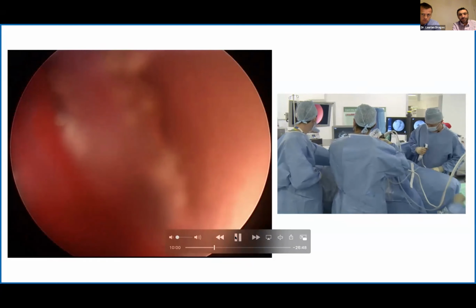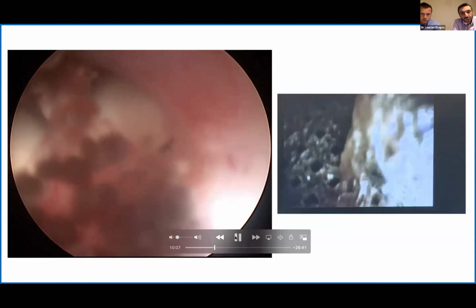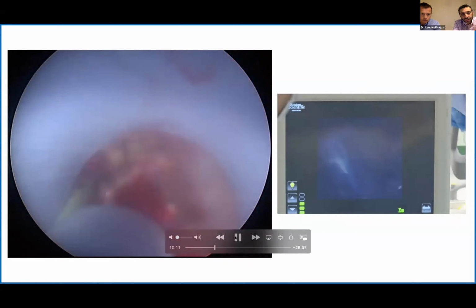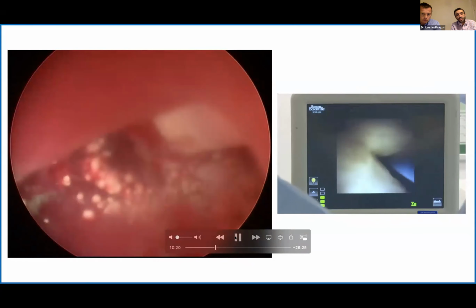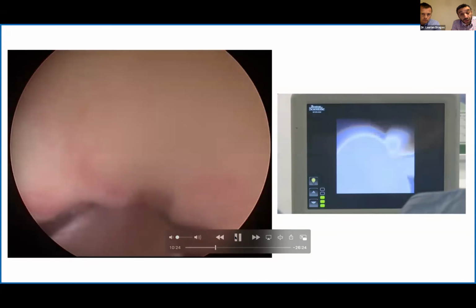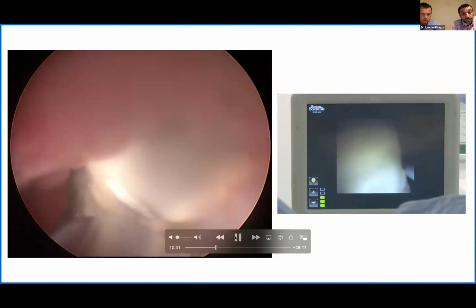You can see that we've had a direct puncture to where we needed to be, rather than getting access anywhere that we could. You can see that there's also a fair bit of small stones lying around, and you can see our wire there, and I've already started to use the suction with a bit of ultrasound to try to fragment the stones. As you can see, it is fairly efficient. Actually, this was quite a hard stone, and the average Hounsfield unit was 1400, so we suggest a fairly hard stone.